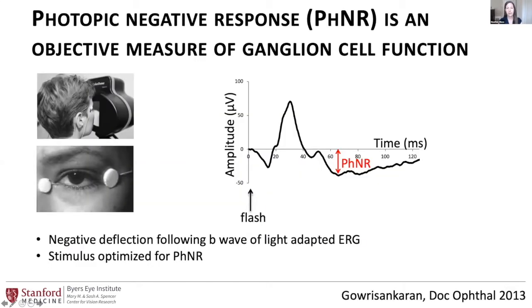So one option is electroretinography. The ERG is created when light is flashed at an individual, and then the electrical activity of the eye is measured using this thread electrode that's put in front of the eye. Usually it's done in a very specialized setup in a dark room where there's minimal electrical noise, and you flash multiple times and you average all of these flashes to improve signal to noise, and then this is an example waveform that you get.